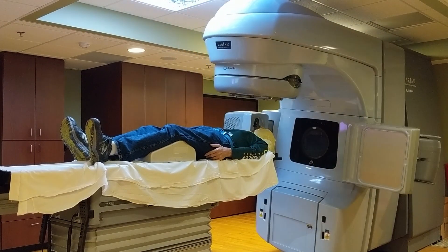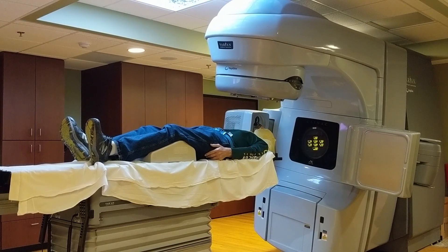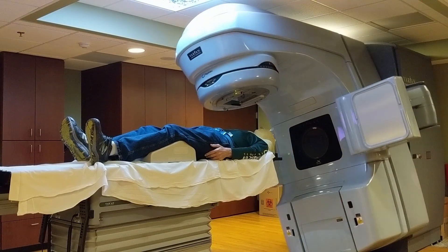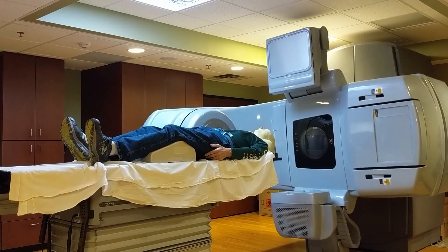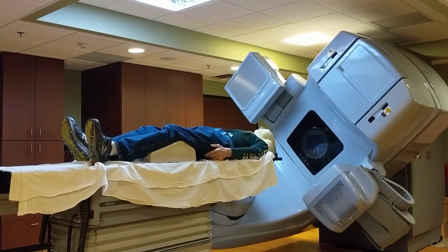The equipment will get to the top of the arc, and you'll see the head turn 90 degrees to reposition the pins, and it will begin another arc of 20 to 30 seconds. And once that arc is completed, the procedure is completed.